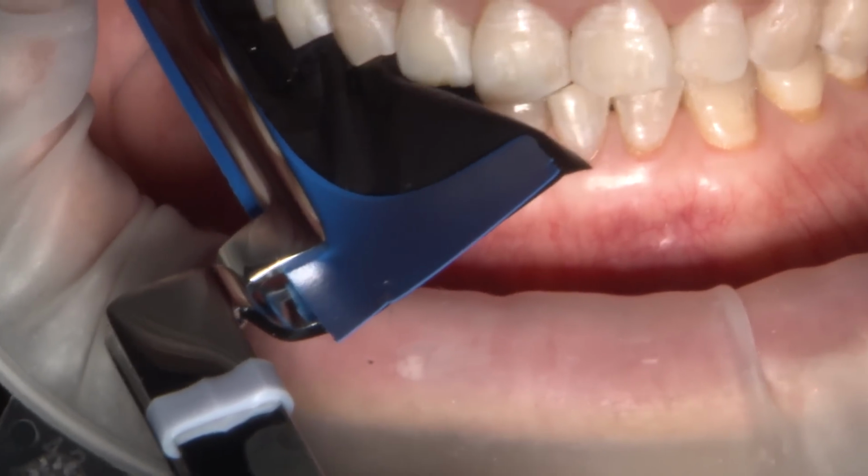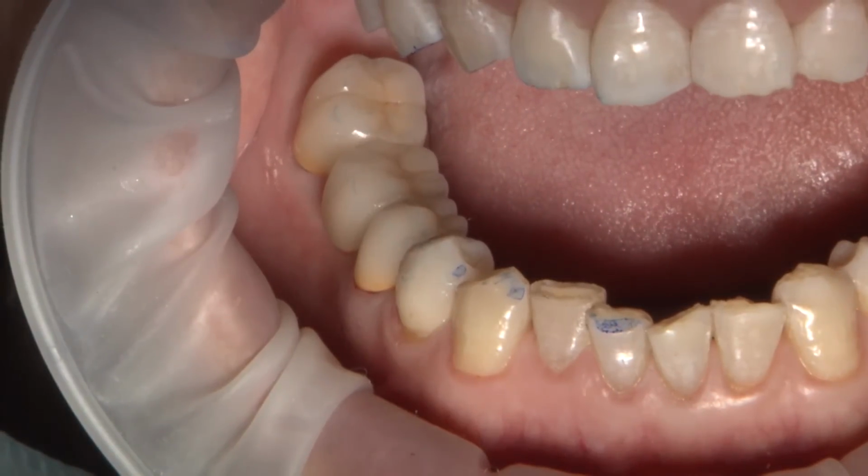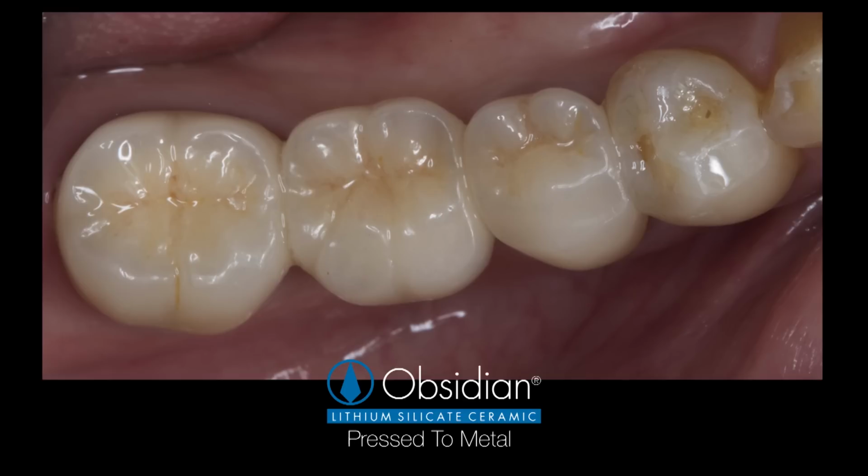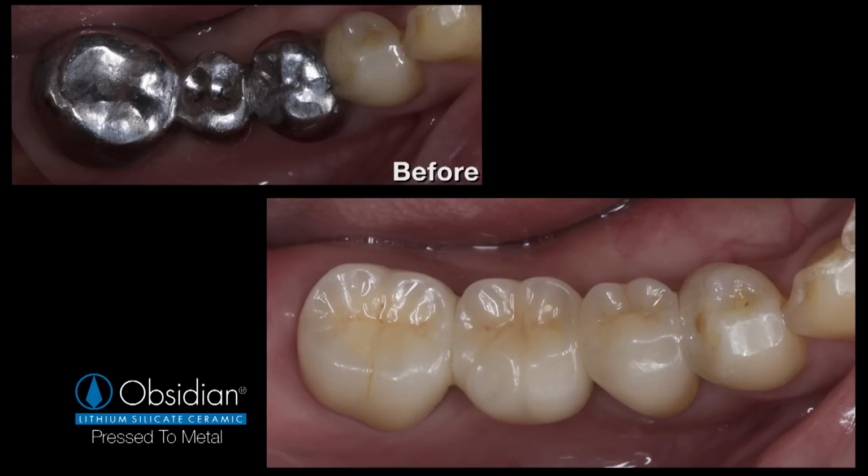and occlusion was verified. Note how the technician was able to alter the previously designed BioTemps bridge and give the pontic a proper contour. In the end, we were able to establish better function with a very aesthetically pleasing Obsidian pressed-to-metal bridge.